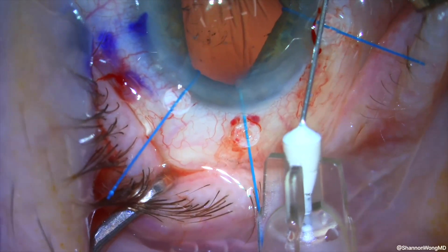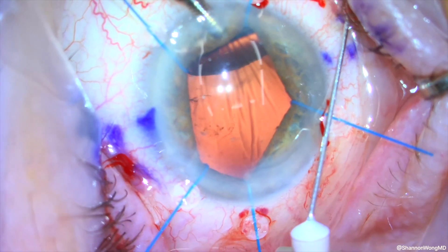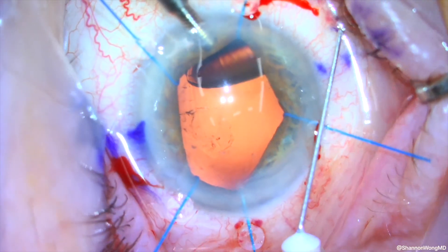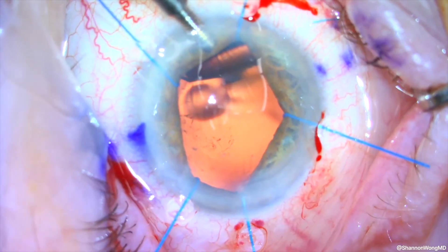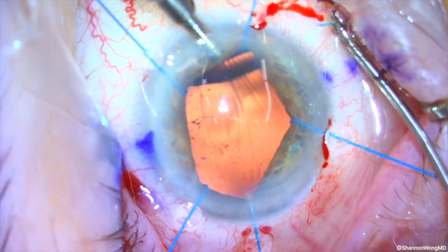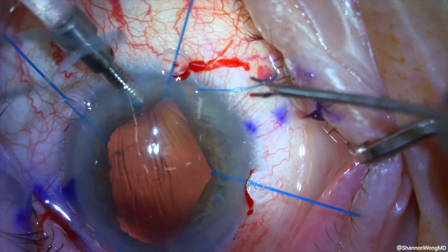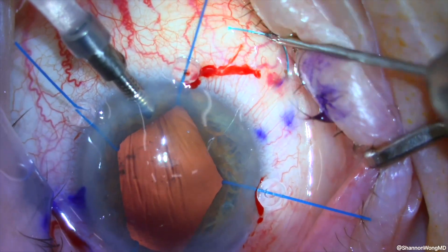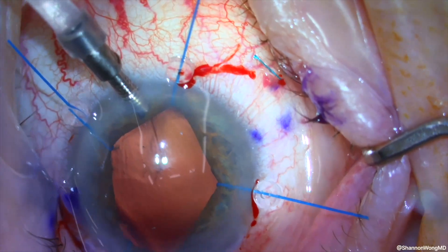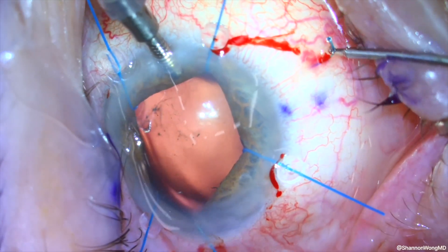Because we need better visualization of the left haptic to create our terminal bulb, we ask the patient to look down slightly. When he looks down, two things happen: the needle holding the right haptic rotates 180 degrees, and the left haptic is drawn back into the eye. Now we have a situation where we can only see the right haptic, and we cauterize the right haptic to create a terminal bulb.